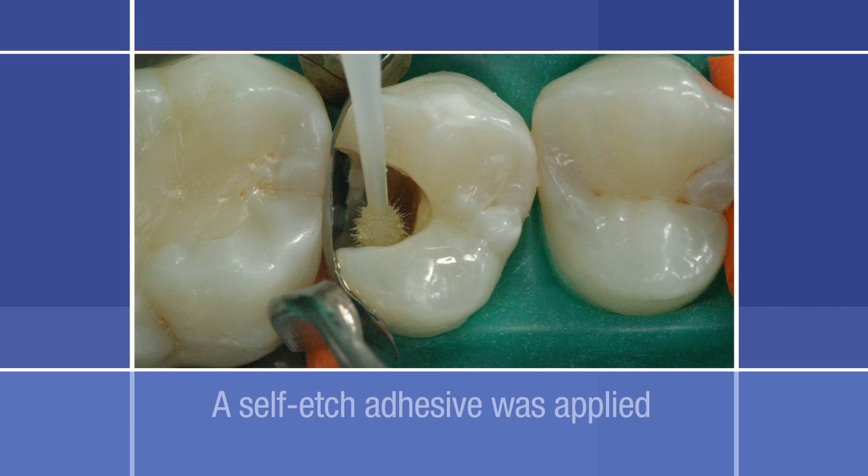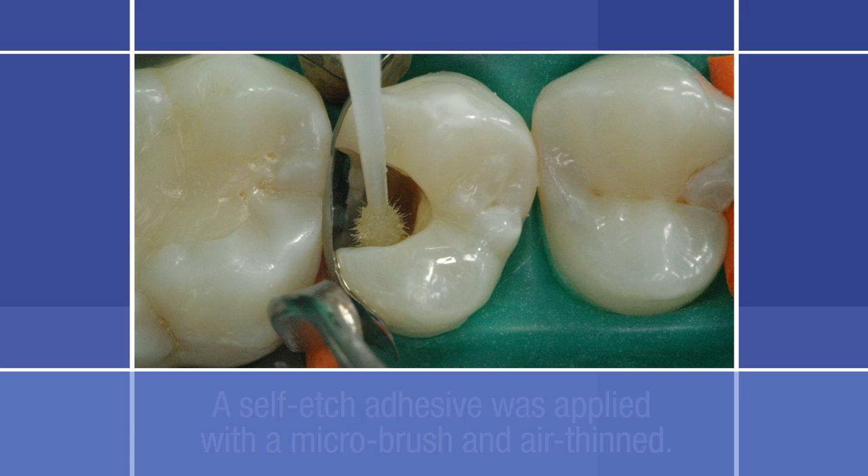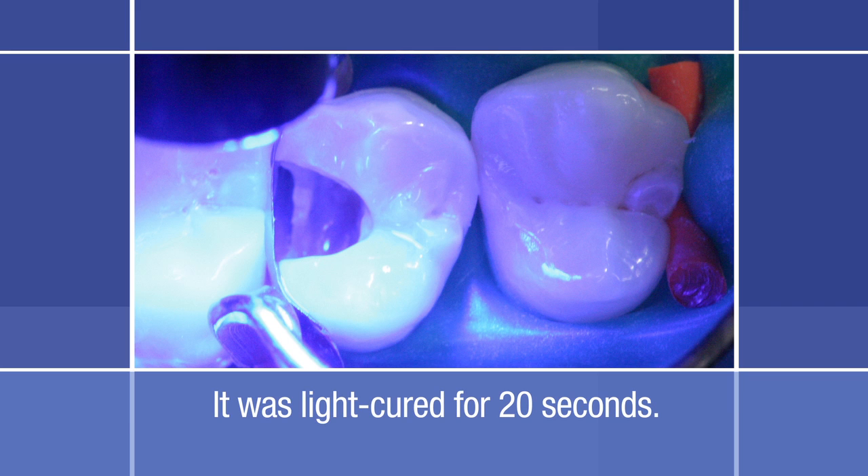The matrix band was kept in place by the matrix retainer. Considering the depth of the cavity and the pulp proximity, a self-etch adhesive was used. If desired, a liner such as Vitrebond Plus Light Cure Glass Ionomer could be placed on the pulpal floor, followed by a self-etch or total-etch adhesive system. Here, the adhesive was applied with a micro brush and the layer was air thinned, then light cured for 20 seconds.